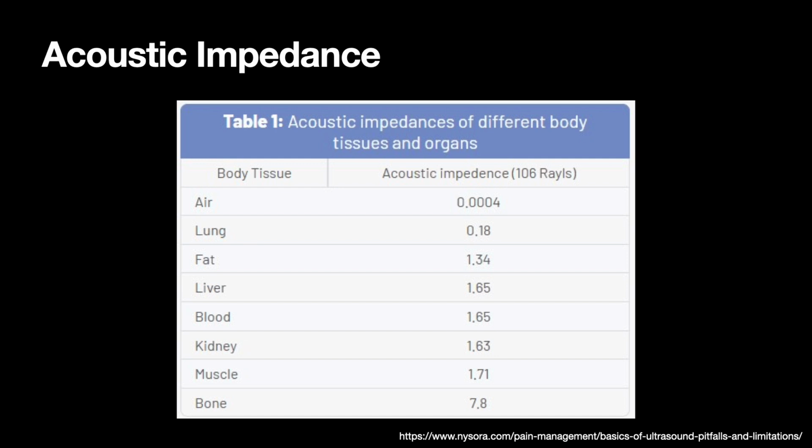And so this helps us see mathematically why ultrasound doesn't see through air very well, and why ultrasound doesn't see through bone very well. And why there's a profound degree of reflection at that air tissue interface and at the air bone interface. And so bone absorbs a lot of this sound, it reflects a lot of the sound. That's why you get that deep, dark shadow posterior to that.